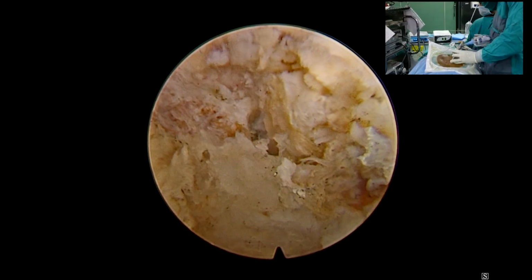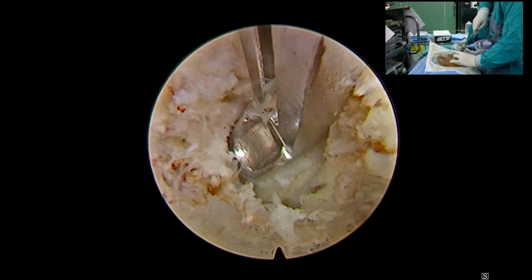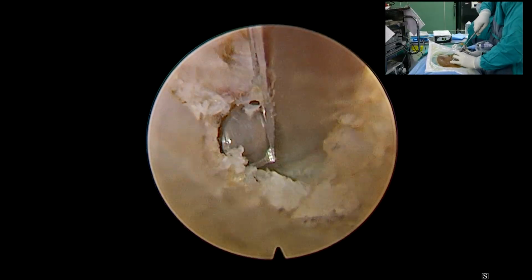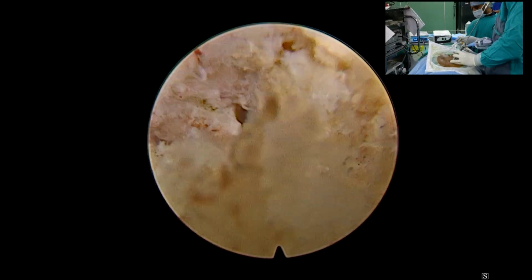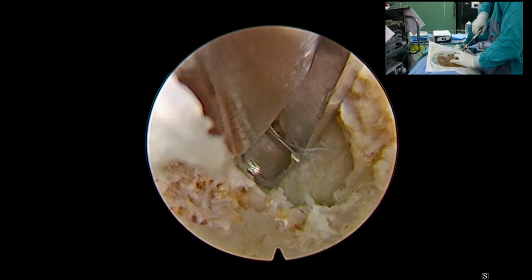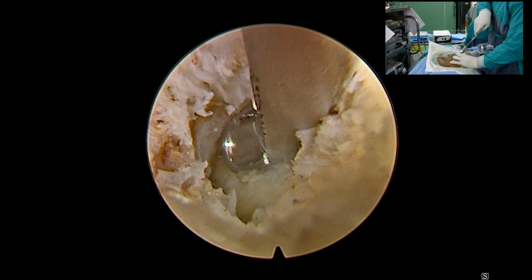Now he's nibbling the inner surface of the IAP. So it is the SAP and lamina junction, I think, or the opposite side lamina.